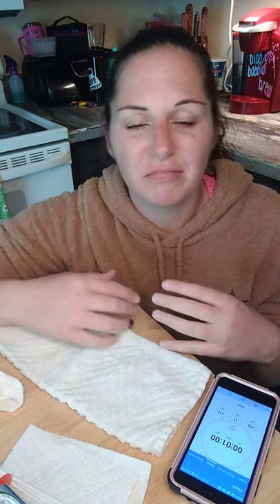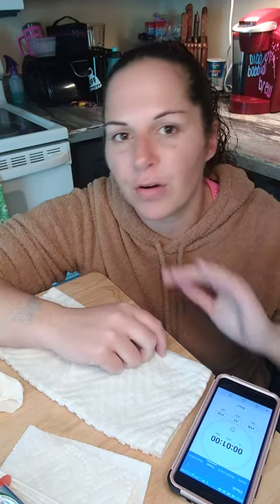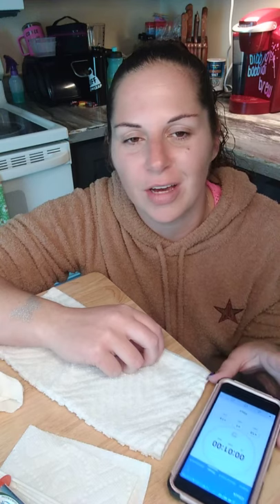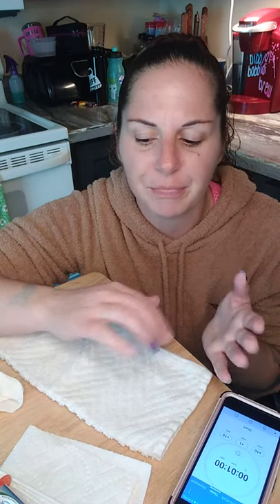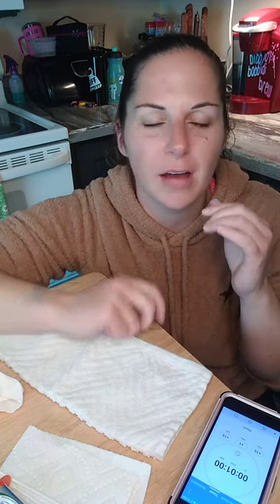If you have extra, take a look. Just trim off a little bit. Having a little hangover is perfectly fine. Do not overcut, guys. Do not overcut. It's just if you have some left over, I didn't have a whole lot left over. I checked and added a little bit more, because my denture's huge. Told you guys I was going to do a video on the extra amount. But it almost feels like my denture's hugging my gums.